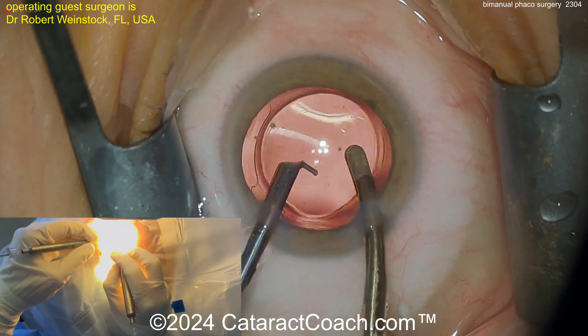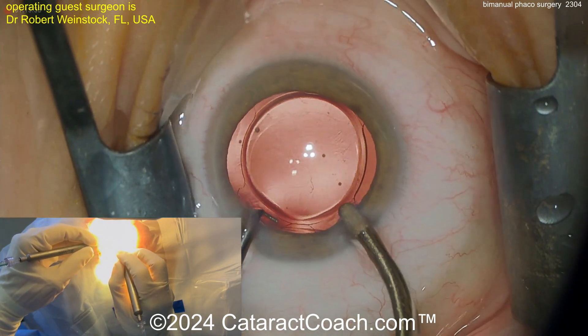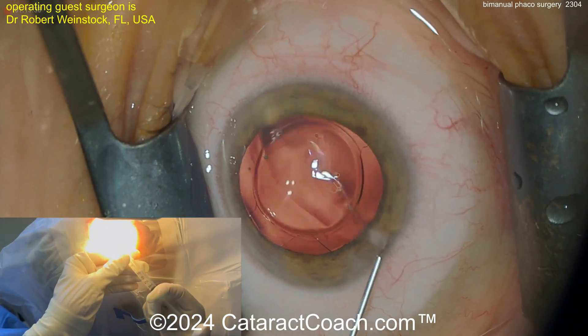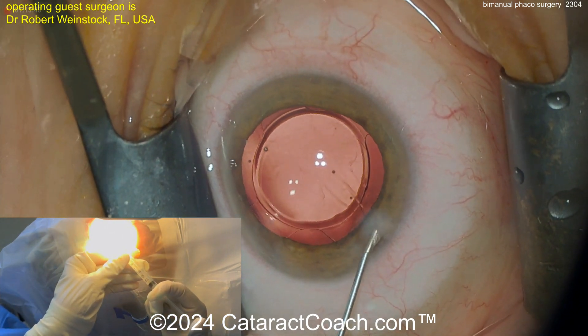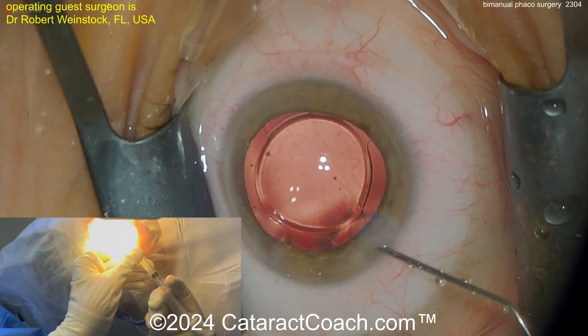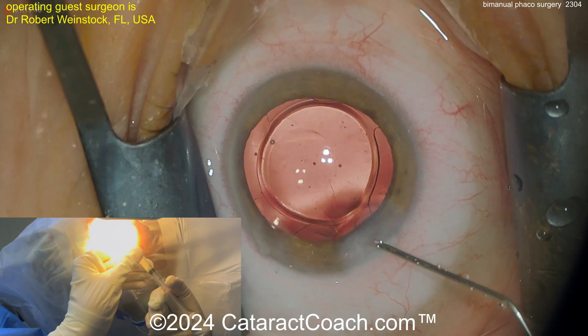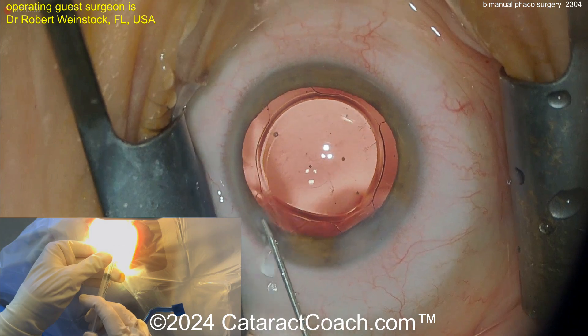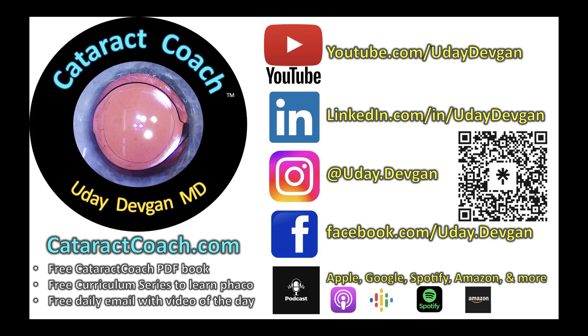At the end of the case, taking out the viscoelastic — the lens is beautifully centered. This patient has a very nice outcome. Seal the incisions, call it a day. So again, a very nice technique. This is called bimanual phaco — it was very popular 15 years ago, kind of waned in popularity. To be frank, I went back to coaxial phaco too. Learn more on our podcast at cataractcoach.com, or search any podcast service for my name or for Cataract Coach.